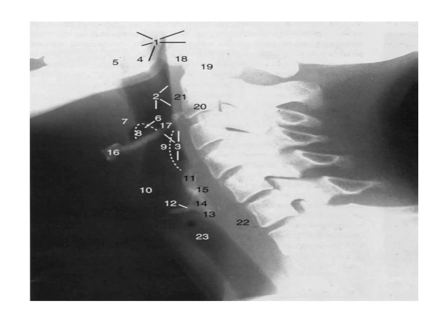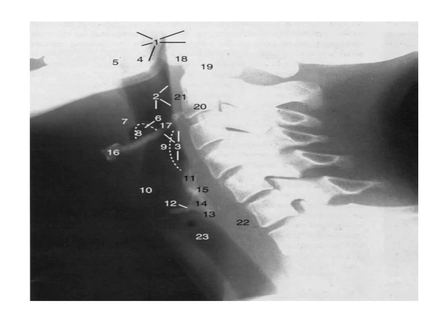On the lateral plain X-ray view, the epiglottis and its calcified parts can be seen. The hyoid bone is visible, and number 16 is actually the hyoid bone, not the thyroid cartilage. Number 12 is the cricoid cartilage, with the thyroid sitting above it. Number 14 represents the ring of the cricoid cartilage, and number 15 is likely the arytenoid cartilage just above it.